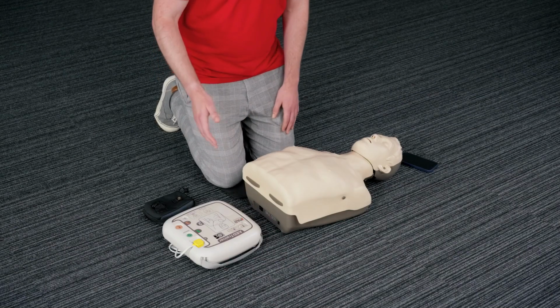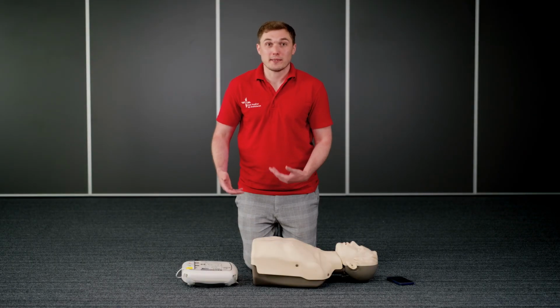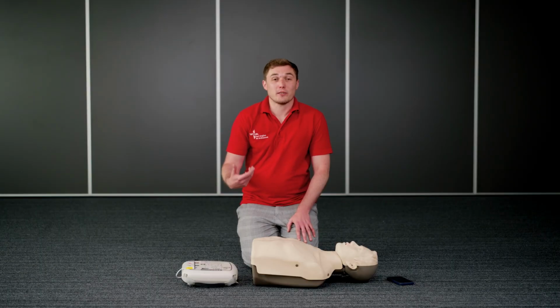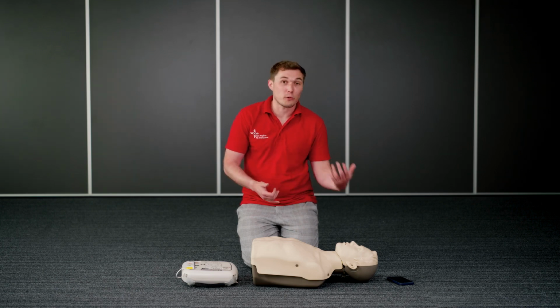I will do that continuously until further support arrives with the AED. At this point, support will have come back with the AED. It's really important that while the AED is being set up, continuous compressions are still going on. These should be turned on and they will talk you through everything you need to do in this process. They will inform you that you need to phone 999, which we've already done.